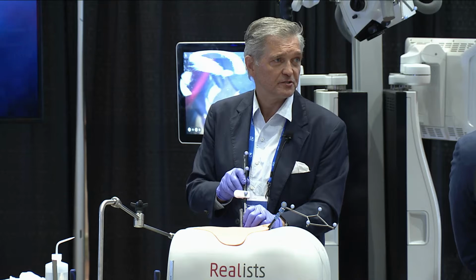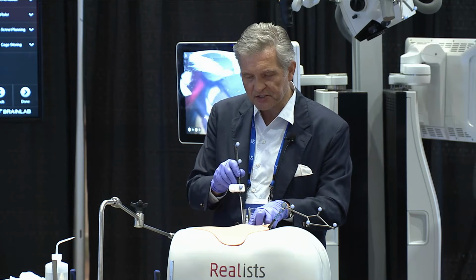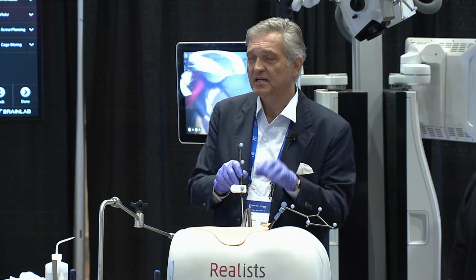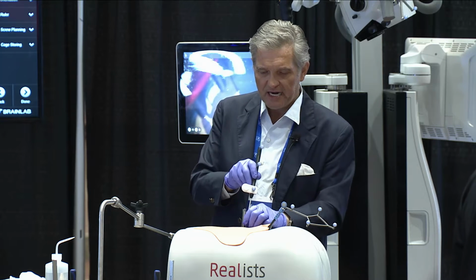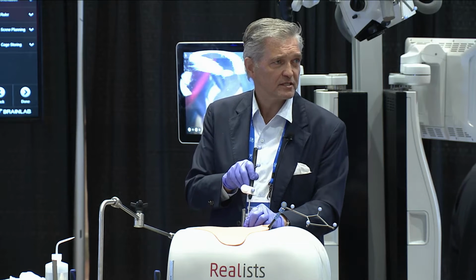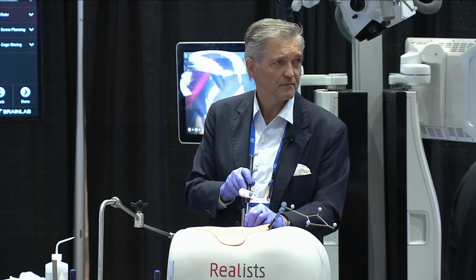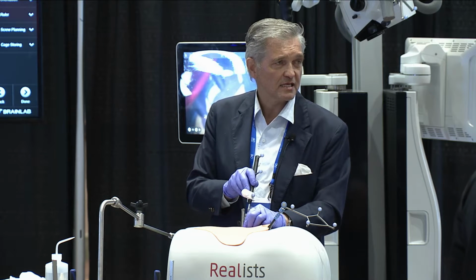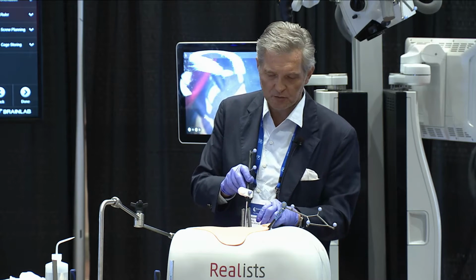So now the next thing, I told you I'm going to make a more medial incision now, same skin incision, but more medial incision in the fascia. And I'm planning that incision with navigation, right? So I want to end up here. That's the L4 lamina. And this is really where I want to end up. I want to dilate the lamina and then place that tubular retractor. I use a 22 millimeter tubular retractor.